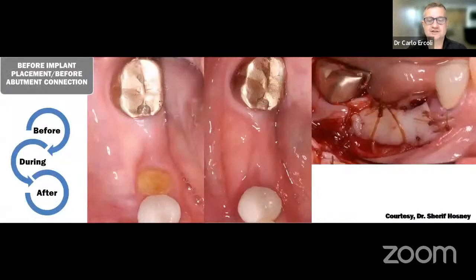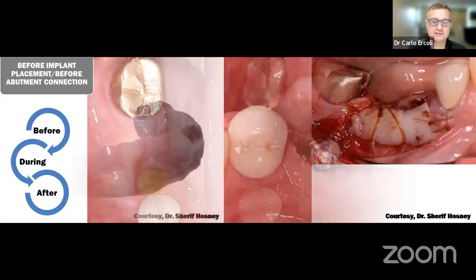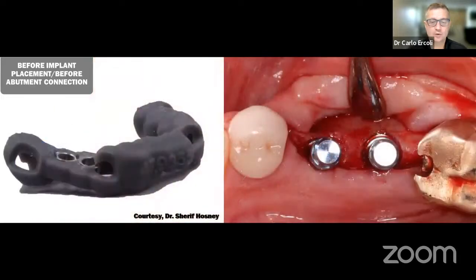So if you look at, for example, a posterior site, like you can see over here, in the 4-5 and 4-6 area where 2 implants will be placed, it's not uncommon to see that there is an invagination of the mucogingival junction, and now there is a scarcity of that keratinized tissue that we really want to have surrounding the entire implant. So in this case, taking just a gingival graft from the palate, as you can see from the right side already sutured in place, is the ideal way to go.